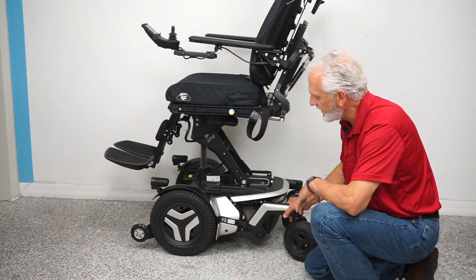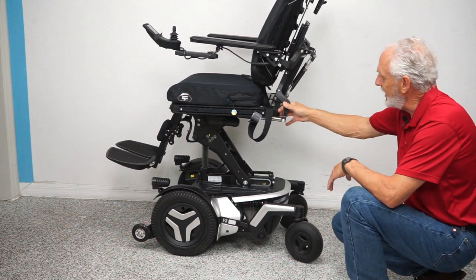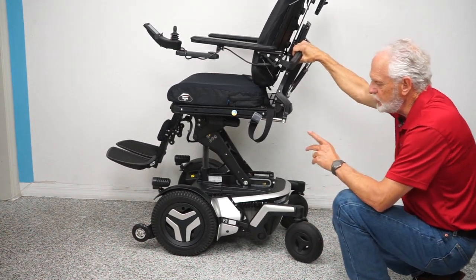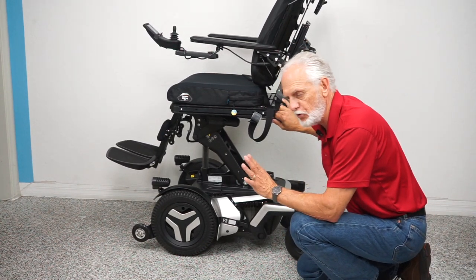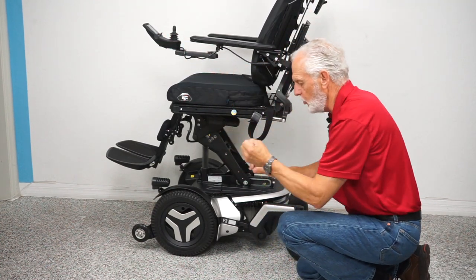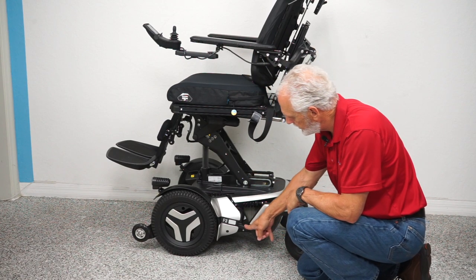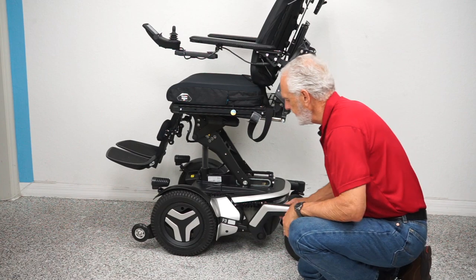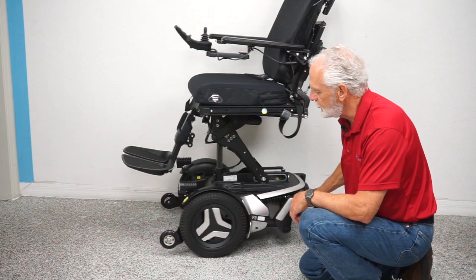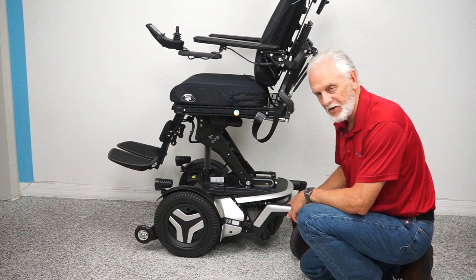The motors go directly to the wheel — that's why they're so quiet. If you want to push this chair, first turn the power off so there's no resistance in the electric motors. Then take that little handle and push it down — now you're in neutral. You have to do both motors. Once done, make sure you put it back in gear.